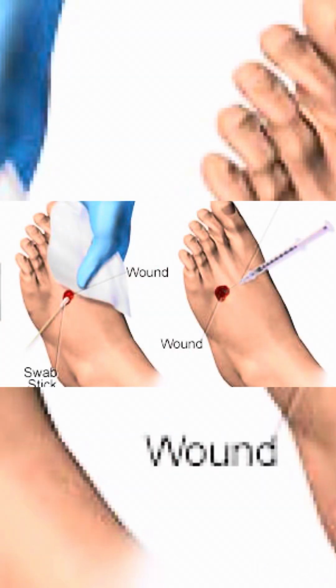This image will give you a visualization on swabbing and aspirating a wound culture. As I mentioned before, with the superficial wound, you would use a swab to swab around the wound, and you would use the needle to aspirate a deep wound culture.